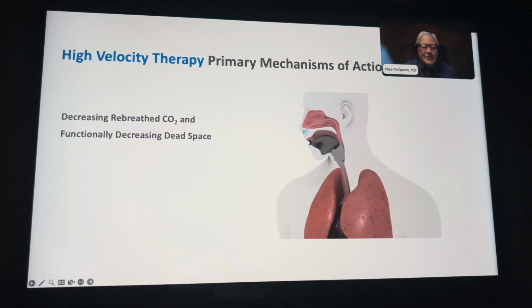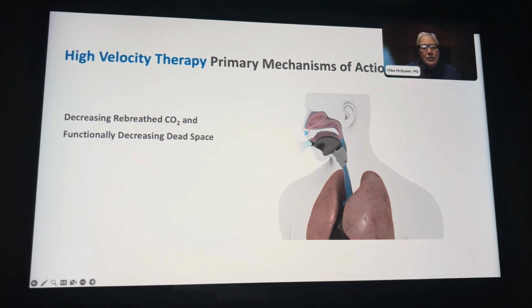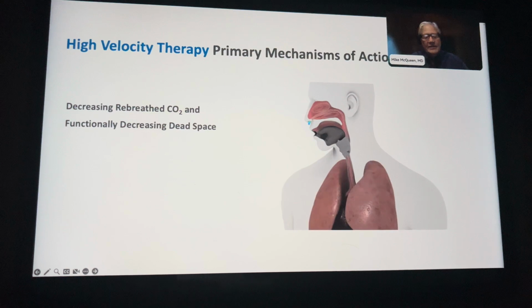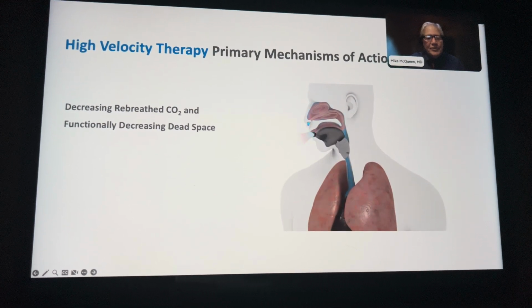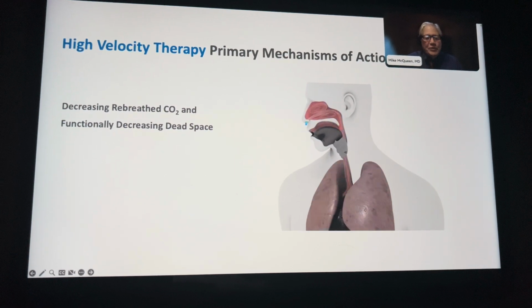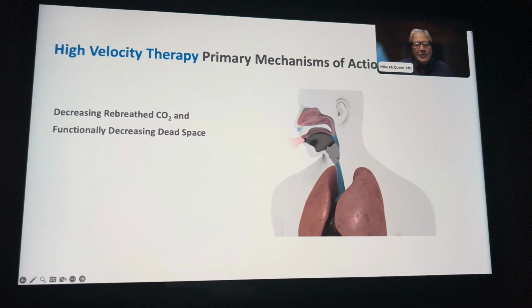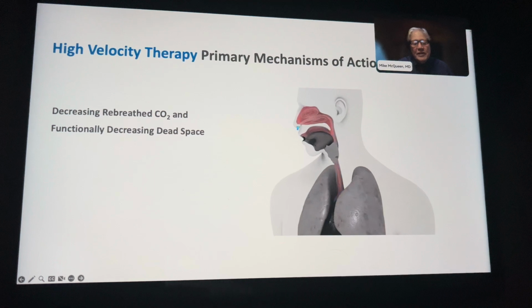So during exhalation, this nasal cannula applied non-occlusively to the nares is going to use that high velocity gas flow to flush exhaled CO2 from the extrathoracic component. And essentially all of that CO2 is removed before the next inspiration. Because of the high velocity mechanism, it flushes the CO2 rapidly. So the patient isn't rebreathing the CO2.